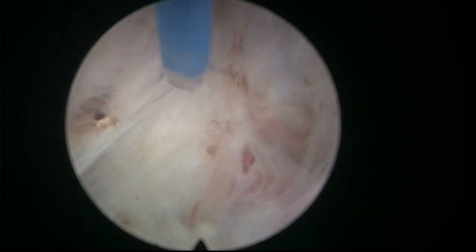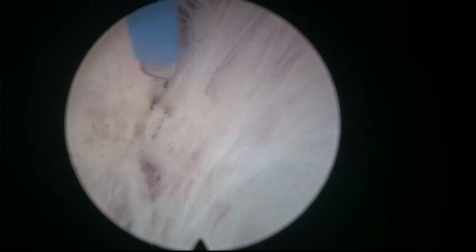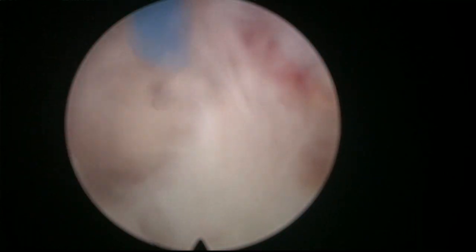We were discussing before that if you're going to start your own experience, it's very important to select the cases properly. Initially, you see that I'm dissecting the plane very, very fast. But initially, you're going to be very slow. You're going to go like that, very carefully, very, very slow. So if you do a very large gland, it might get very tedious and very lengthy. And so my advice is to choose prostates that are bigger than 40 grams, maybe 50, 60, 70.